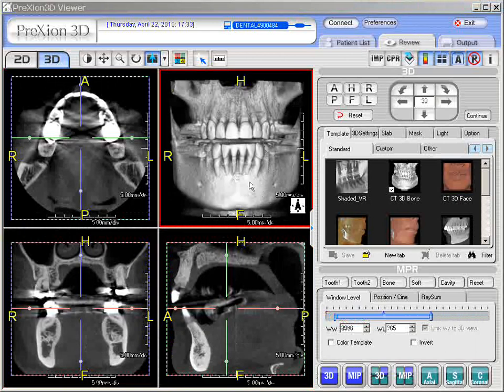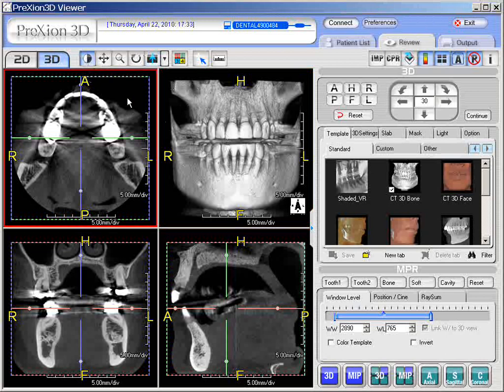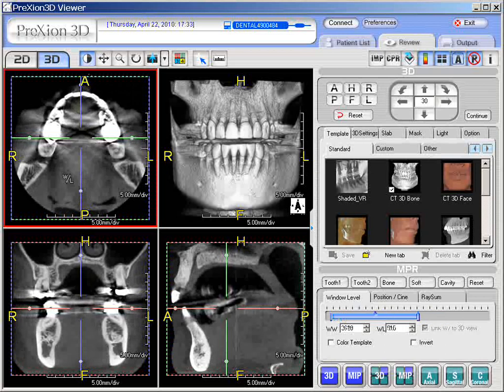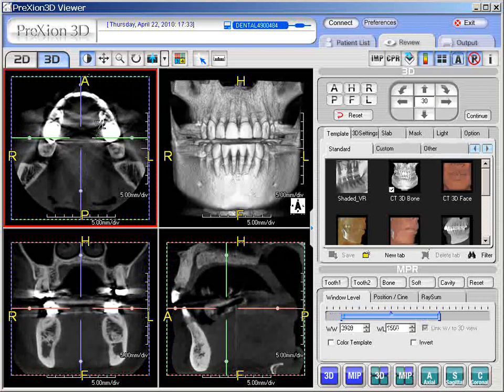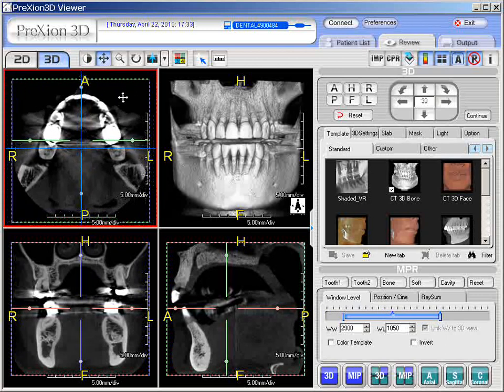You are not limited to just using the mouse functions. For comparison, if we go into these particular icons, notice one is called window level. Clicking it tells us what it is — window level. We know from using the mouse that right and left click is window level. However, if we click this icon for window level, the left click of the mouse is now dedicated to that function. The next icon is pan — you know it as the right click of the mouse, but once the icon is selected, the left click of the mouse becomes active for that feature.